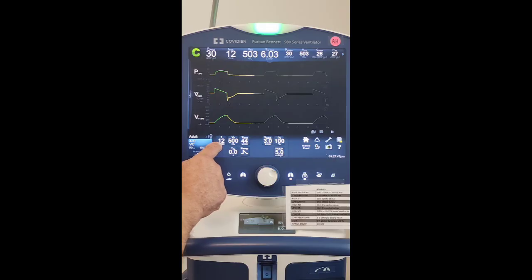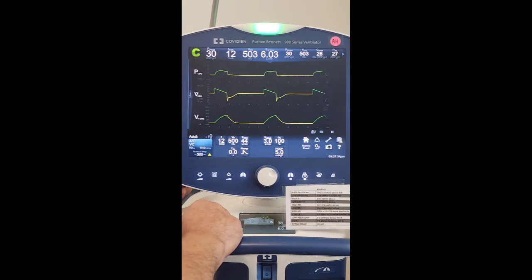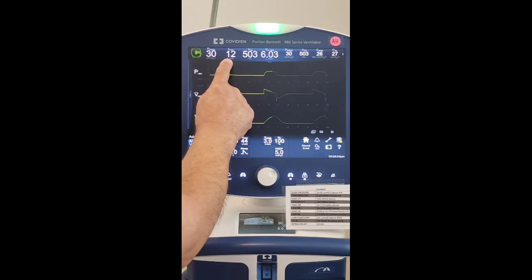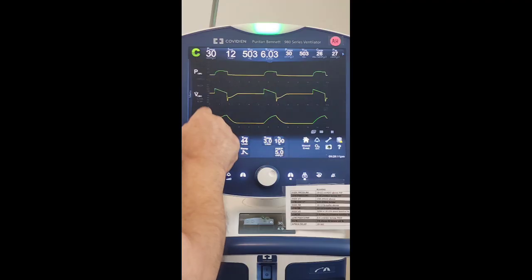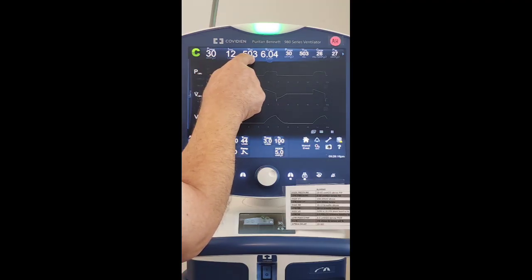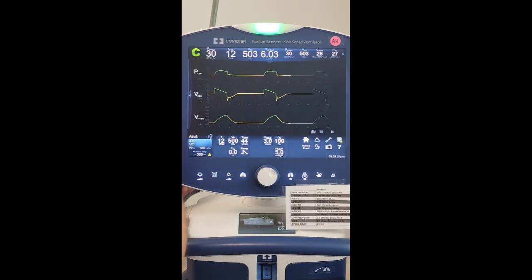So I already inputted a rate of 12, 500, and the peak flow, I just left it as is, Vmax. We'll look at the IE ratio in a second. Here's the respiratory rate being returned from the patient. These are all what we inputted into the ventilator. So we have respiratory rate of 12, tidal volume 500, and minute ventilation, like I said, 6.